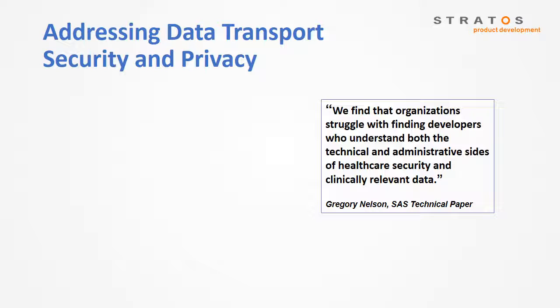So how could the problems we just saw with the monitoring system have been avoided? First, it turns out it's not realistic to expect even senior developers to be expert in all aspects of a cloud-connected medical system. So it's important to start your phase zero by putting the right team in place. You want to build and involve your team at the start to help create the system requirements. Of course, you know that there will be development and quality engineers on that team, but there are other team members your project can't do without.